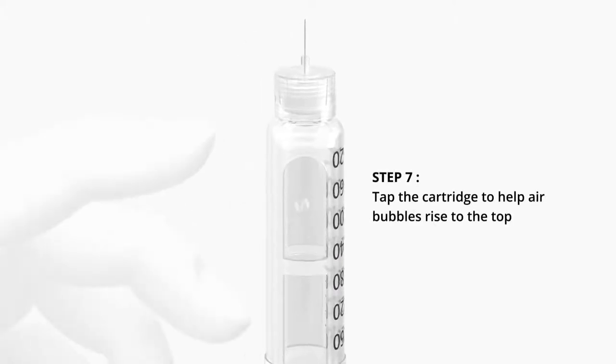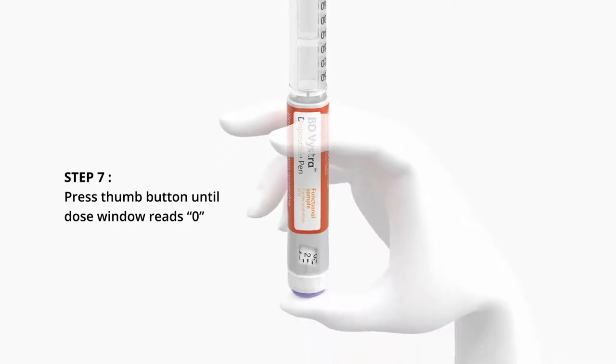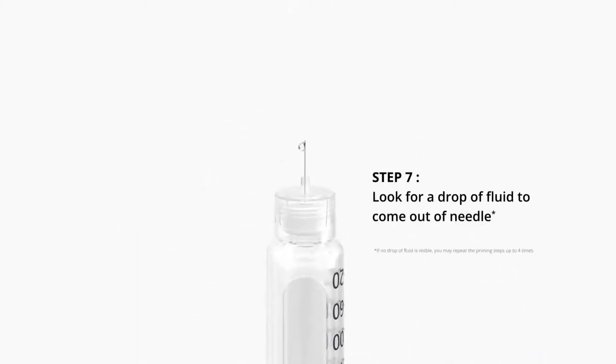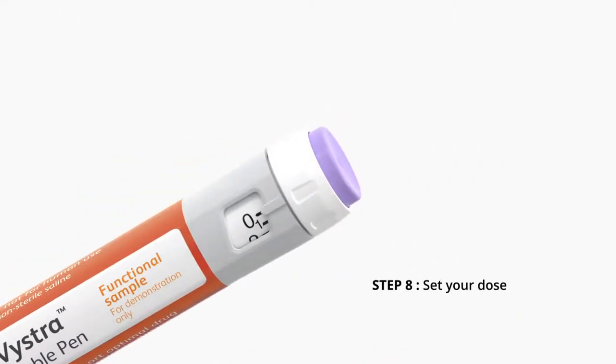Step 7. Tap the cartridge to help air bubbles rise to the top. Press thumb button until dose window reads 0. Look for a drop of fluid to come out of needle.